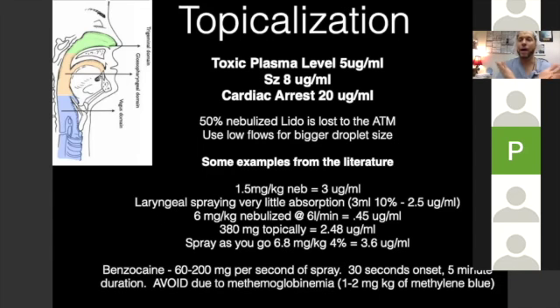That's predominantly your gag, the 9th nerve. So if I can get the palatoglossal arch on each side with a 1-second spray, I'm going to use about a third as much propofol as I would have, because that scope is going to cause the initial gag. So a 1-second spray, and always be able to recognize methemoglobinemia if it occurs.